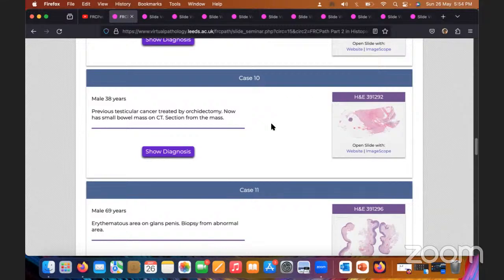One hypothesis is that as the virus actually comes from the sensory ganglia, and the sensory nerve endings end near the follicular unit, the follicular units are affected. So that is one hypothesis. So you favor it, that I favor varicella zoster. I will do an IHC which is very specific for varicella zoster. It will help to differentiate. So it is expected that you should differentiate between these two. Yes.